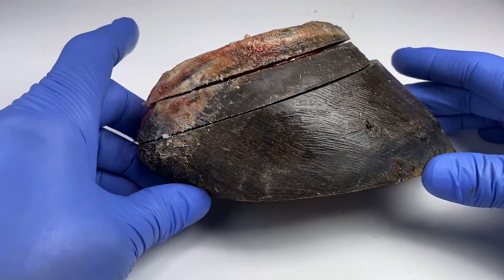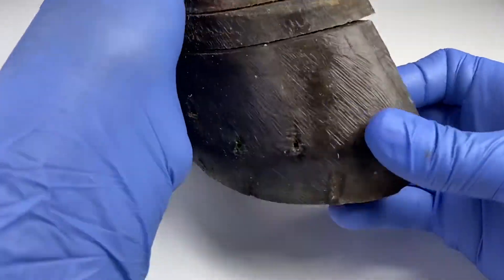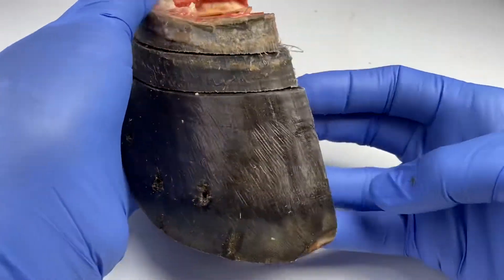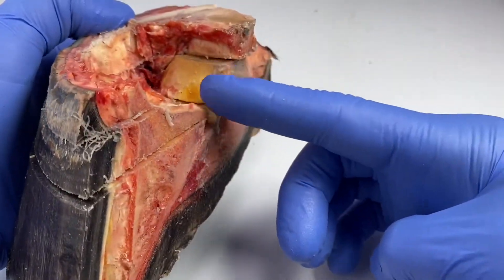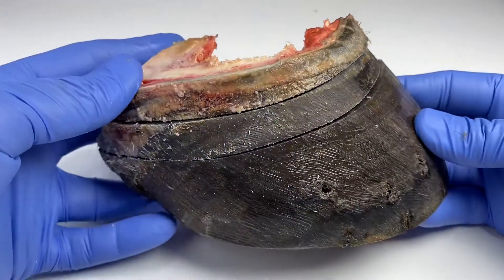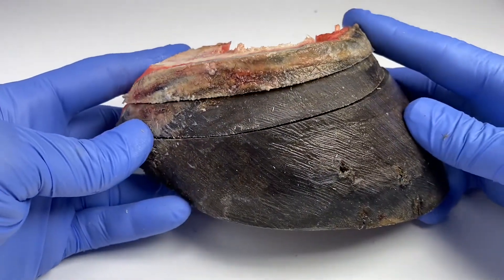This is the right foot from the horse called Mr. M. I've already done a sagittal section through the middle and I've taken out the navicular bone as well because I wanted to see what that looked like inside. That's on a separate video, but let me just show you what I've done now.